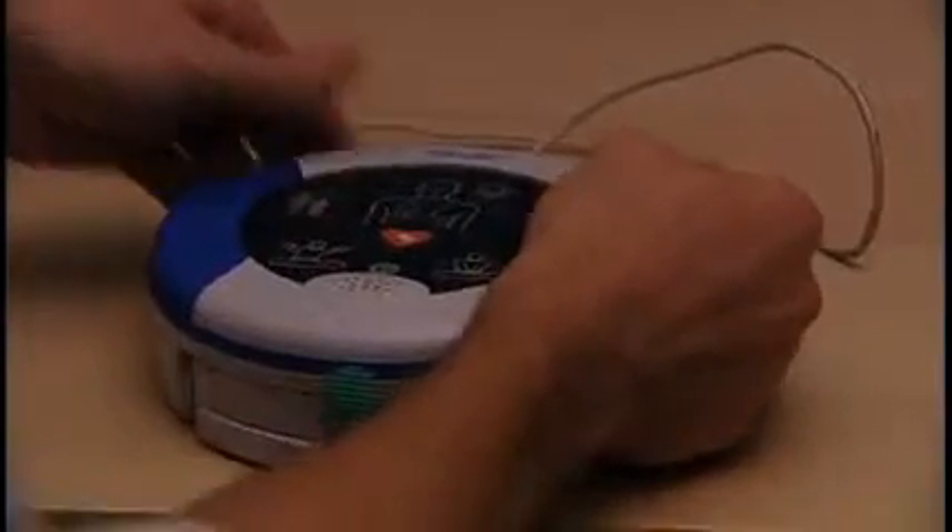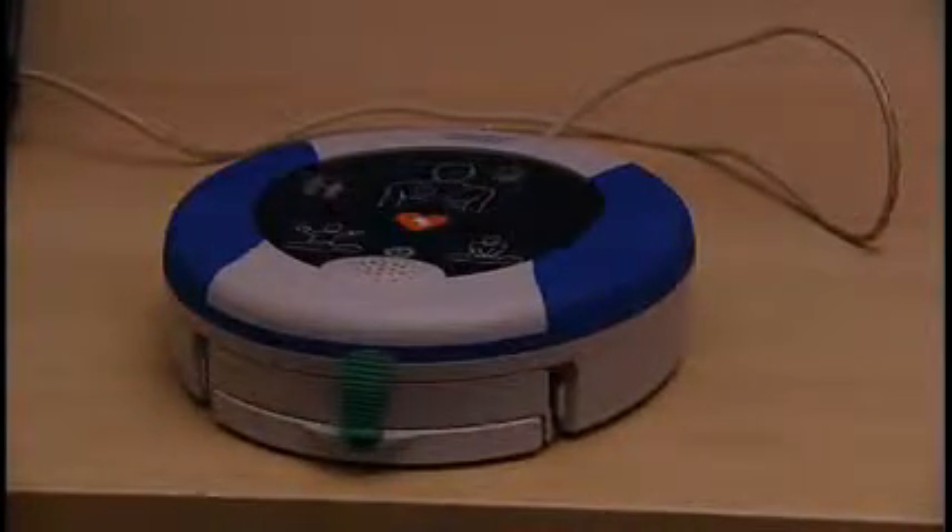The Samaritan PAD logs up to 45 minutes of heart rate information after use. A physician may want the electronic information from the device for treatment. A data cable is available from your authorized dealer or Heart Sign for downloading the event data. After downloading the event data, please erase the data from memory. Contact Heart Sign Technical Service at the number at the end of this video for assistance.